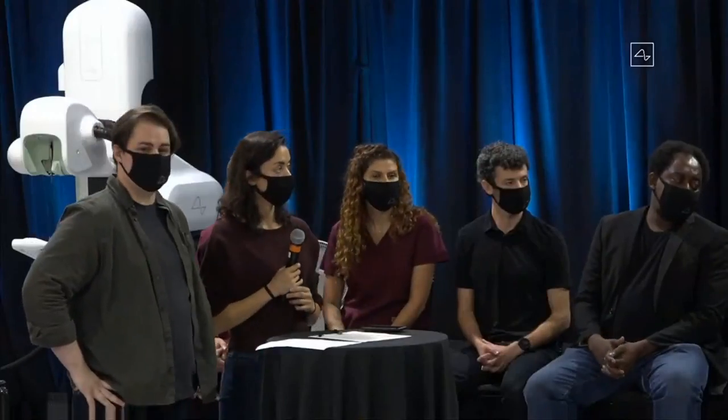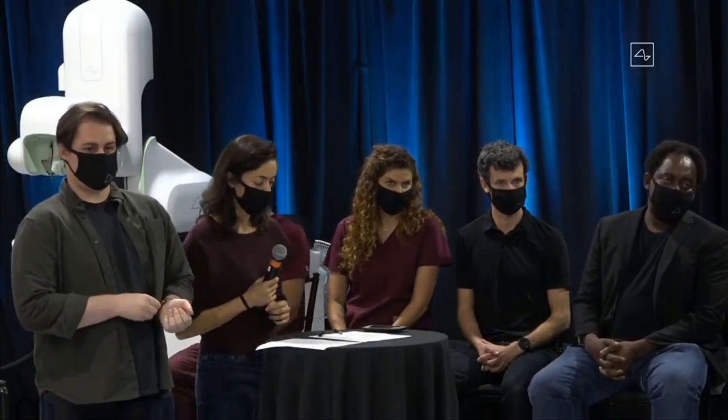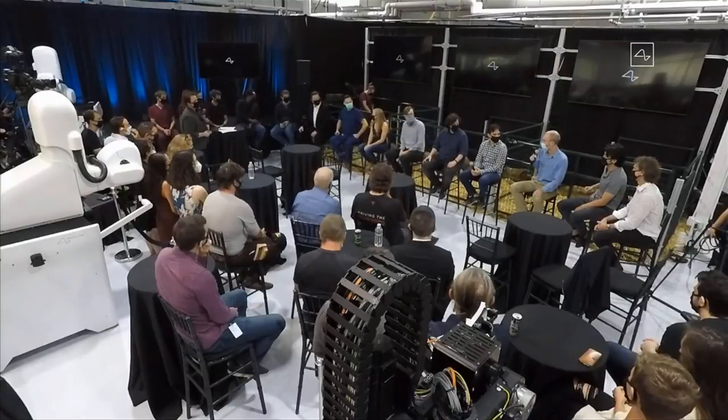The robot is designed, the full length is like 7 or 8 centimeters. Right now we're designed for about 6 millimeters, but the actuator itself isn't actually limited to 6 millimeters. It can go much deeper. In addition to scaling out to the rest of the surgery, we're also scaling to deeper, which is mostly a sensing problem. The ability to avoid deep vasculature is an interesting problem that we're working on in the robotics world here. So yeah, lots of cool problems in the robot. And you're leading robot engineering? Yeah, I'm Ian. I lead the robotics program here.